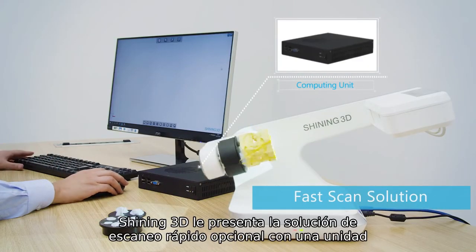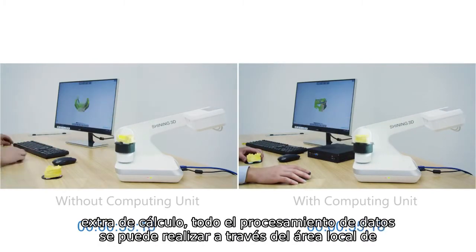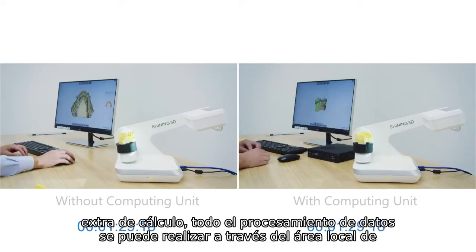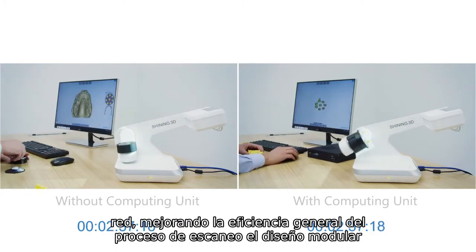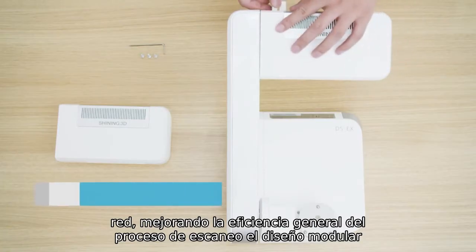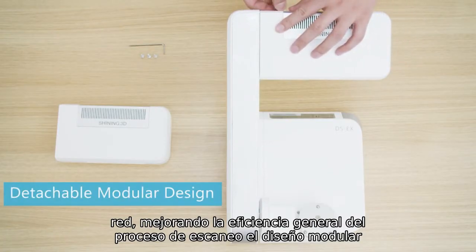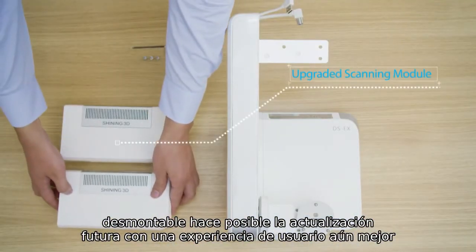Shining 3D presents an optional fast scan solution as well. With an extra computing unit, all the data processing can be done through the local area network, improving the overall efficiency of the scan process. The detachable modular design makes possible future upgrades with an even better user experience.